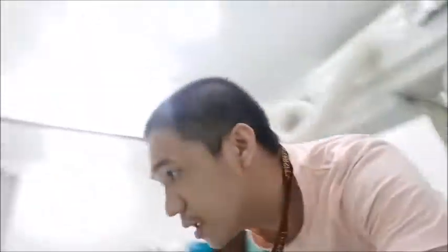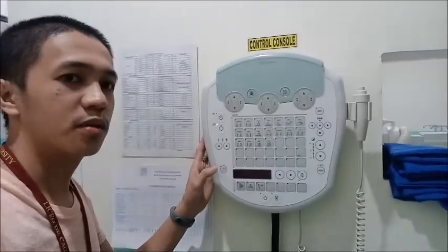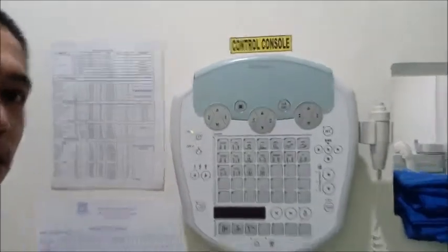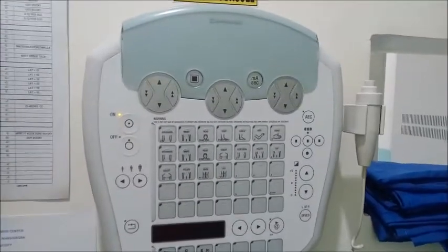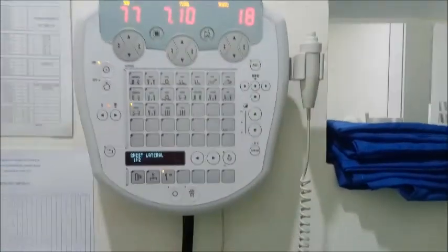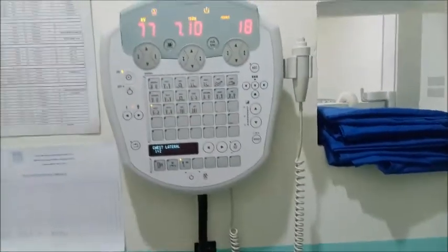And then right after switching the main switch, we go to our control console. Please look. We have our control console. That is, like in the previous video, you have the on button. And then, for example, the examination is chest. So again, this is in the previous video.